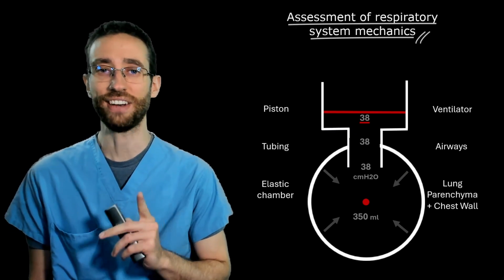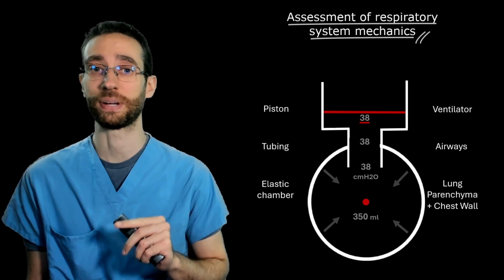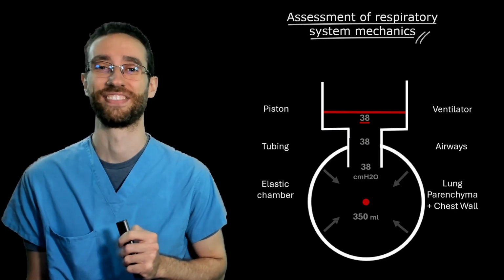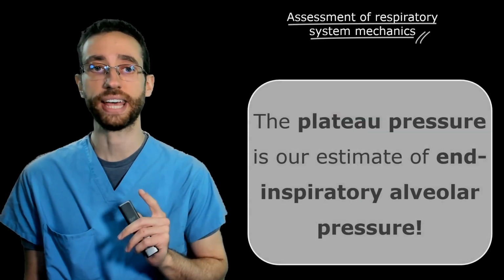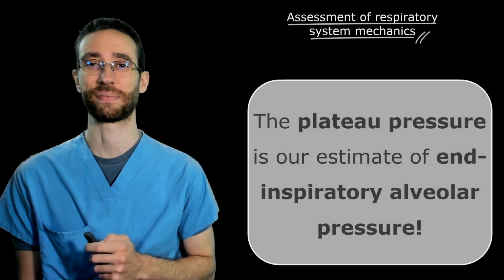This pressure, generated by the elastic recoil of the lung and chest wall, measured at the airway opening after an end-inspiratory hold, is the famous plateau pressure. The plateau pressure is our estimate of end-inspiratory alveolar pressures. Let's look at some cases.